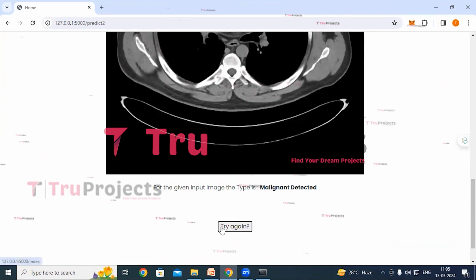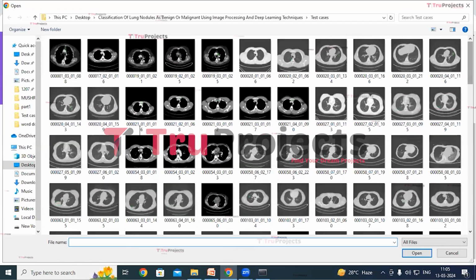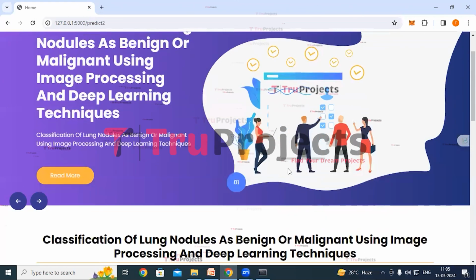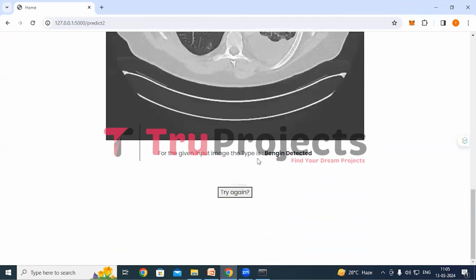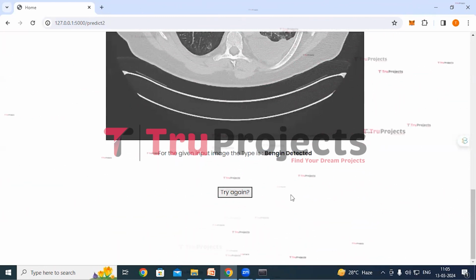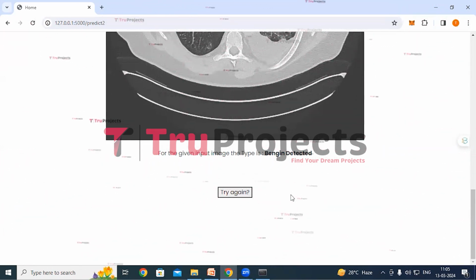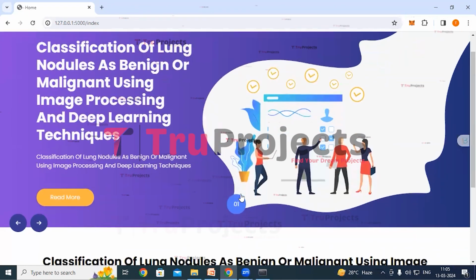We'll try again. Click on try again button. Click on choose file button. So this time I'm uploading this one and click on open. The image is loaded. Now click on upload button. This is the uploaded image and here we can see the classification type, that is benign. So similarly, we can upload any radiological image and can get the classifications if the lung nodule belongs to benign, malignant or normal class.